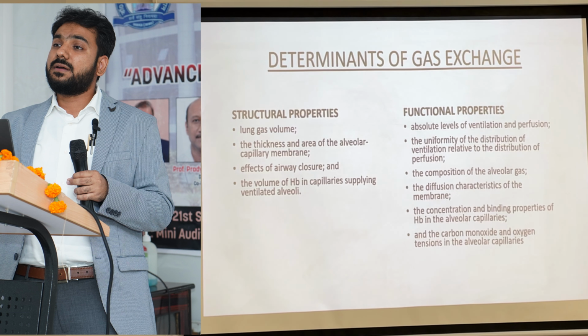Now there are functional properties which are going to affect the DLCO. That is the absolute levels of ventilation and perfusion, and what is the ventilation perfusion matching that is happening there. The composition of the alveolar gas, whether what we are inhaling is filled with oxygen or not. The diffusion characteristics of the membrane, the concentration and binding properties of hemoglobin in the alveolar capillaries, and the carbon monoxide and oxygen tension that is present in the alveolar capillary. So a lot of factors that are ultimately having a say in what the DLCO test will ultimately say.